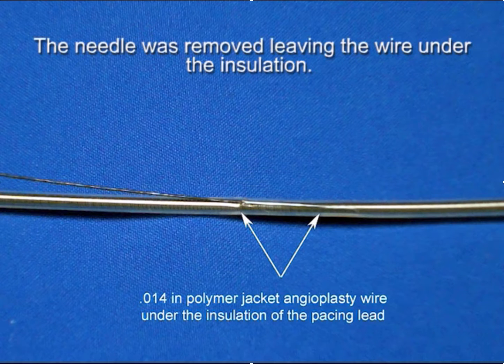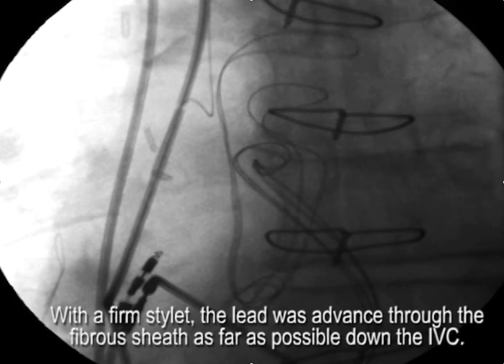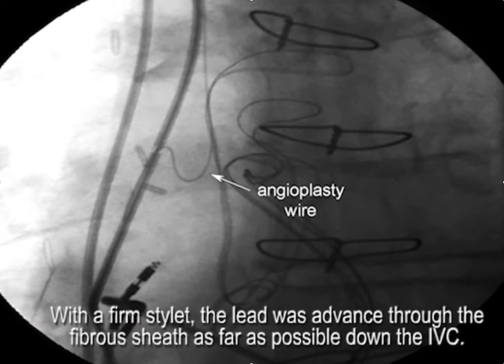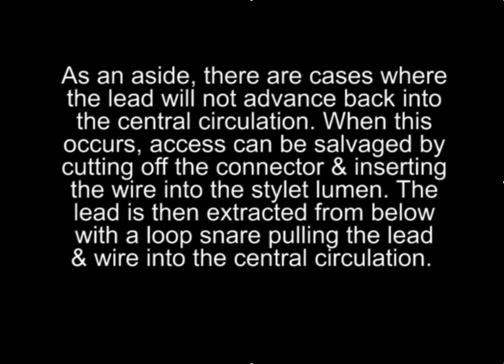The needle is removed, and you can see here we have a section of the wire under the insulation. We then put a stiff stylet into the RV pacing lead and advance the lead back into the circulation with the wire, and here you can see the angioplasty wire has been carried into the circulation with its tip underneath the insulation.